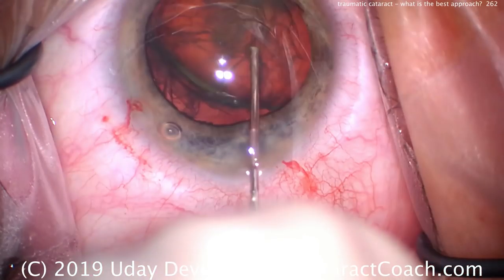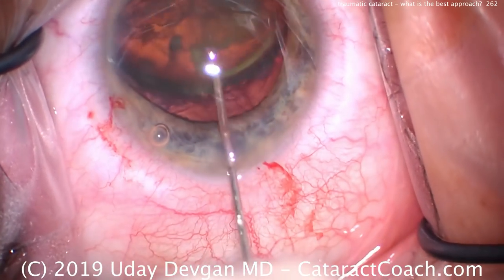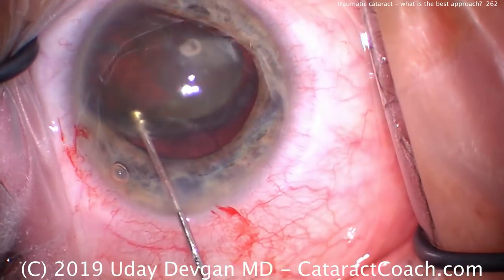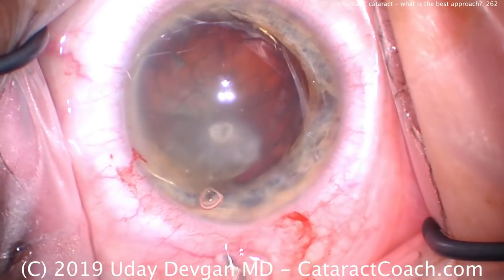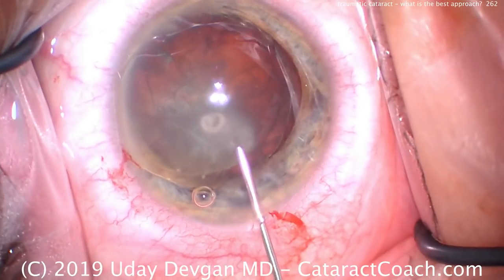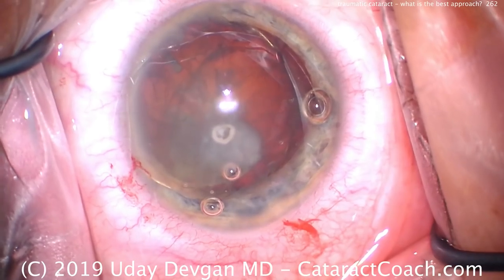And the reason is, I don't want to put any stress on the area of potentially bad zonules. If there's a posterior capsule defect, I want this lens away from it. So we'll also inject viscoelastic underneath it. Get that lens up. Now we have the whole lens in the anterior chamber. Recoat the central endothelium with our dispersive viscoelastic.